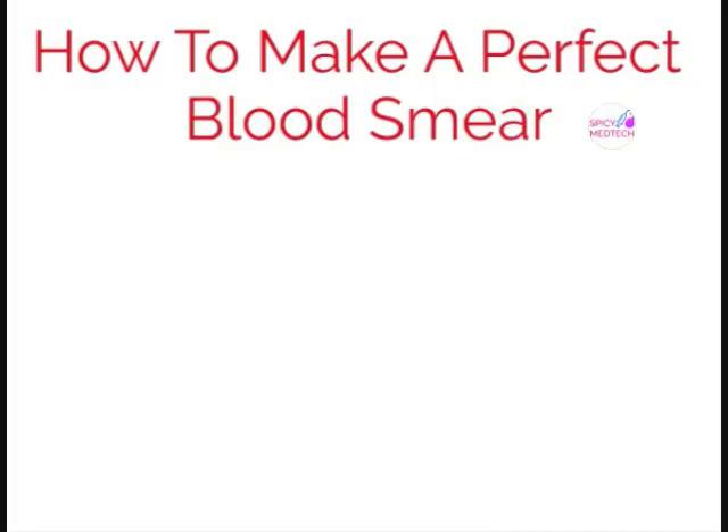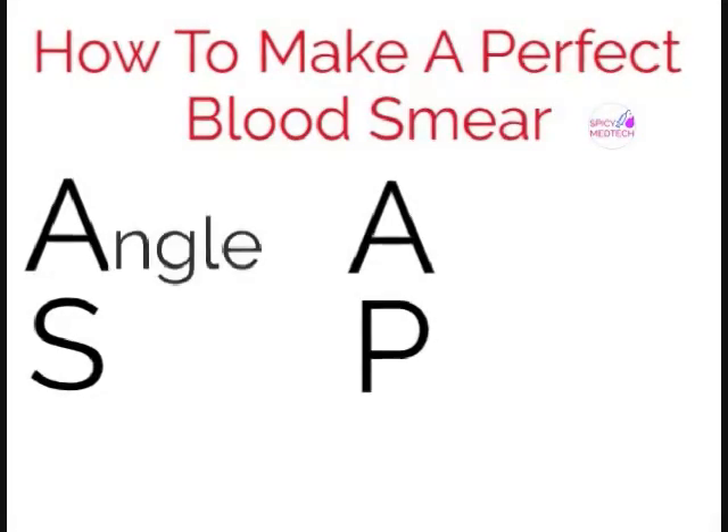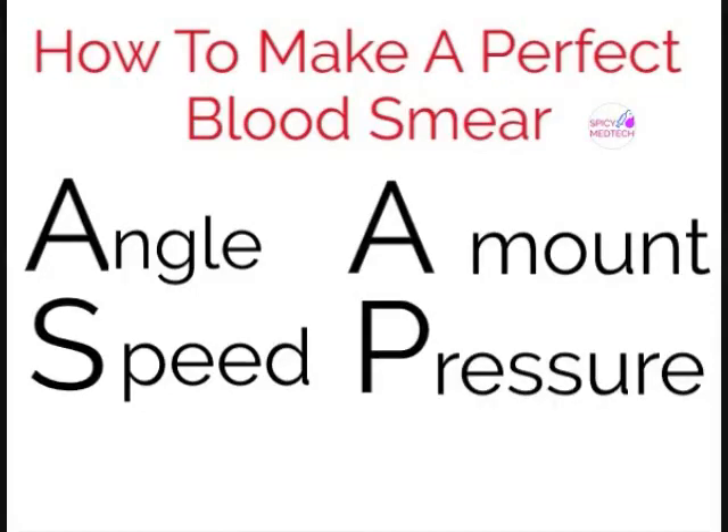To make a perfect smear, one must follow four simple letters: ASAP. A for angle, S for speed, A for amount of blood, and P for pressure. I will be showing you sample slides if these conditions aren't met.